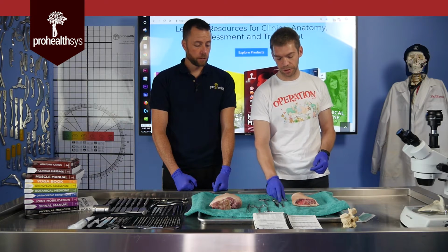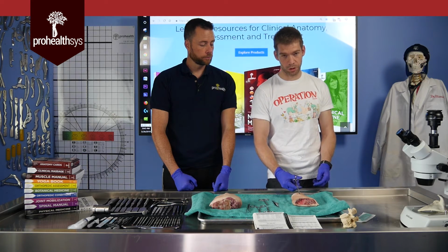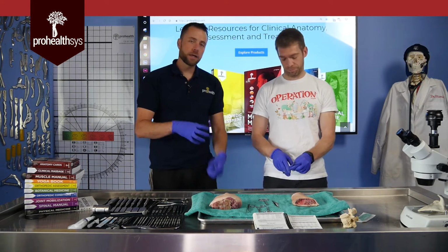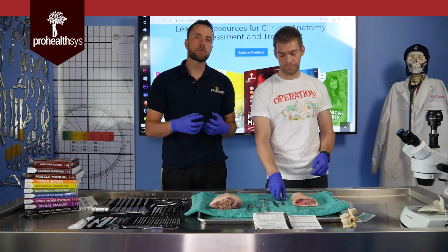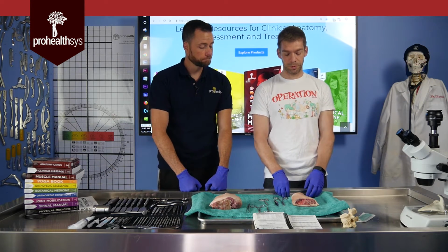The next thing you'll be needing is something to handle tissue that you don't want to kill, okay? If I took these needle drivers, grabbed this tissue and slammed down on it, crunch, that's the end of that tissue. You damage all the capillary beds in that area. All that crush injury means it's very hard for the body to heal from that. So we want to avoid that at all possibility. It would be bad news.